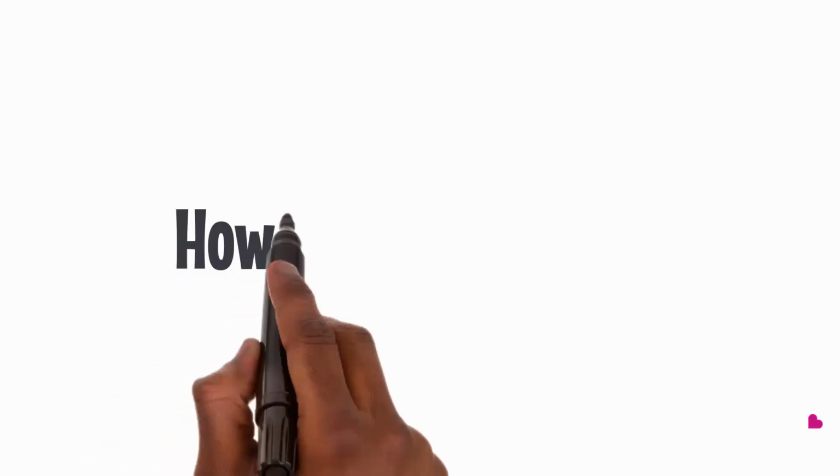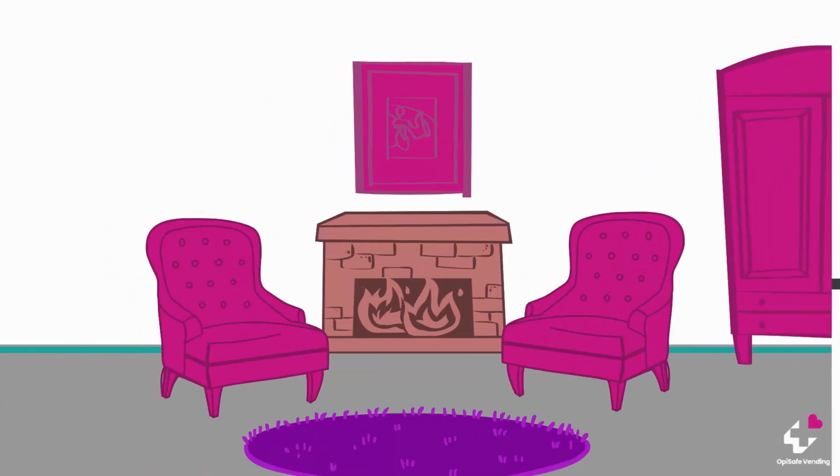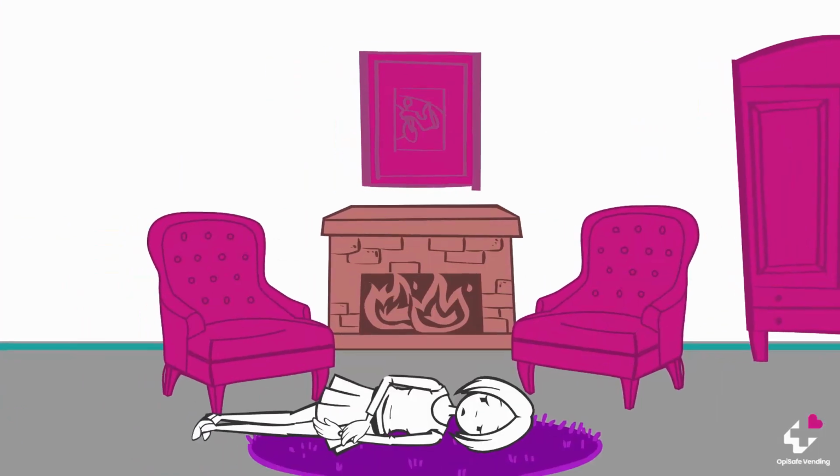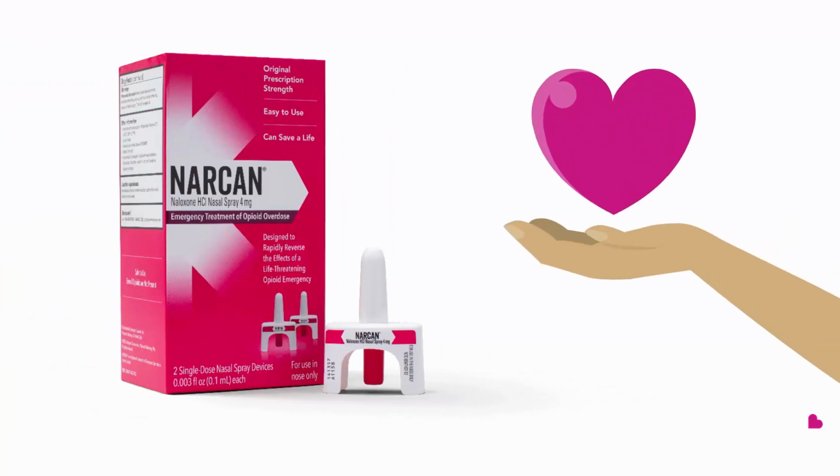How to recognize opioid overdose signs and administer Narcan nasal spray. With the rise in opioid-related incidents, it's more important than ever to be informed about how to use Narcan nasal spray. Remember, your quick response can save a life.